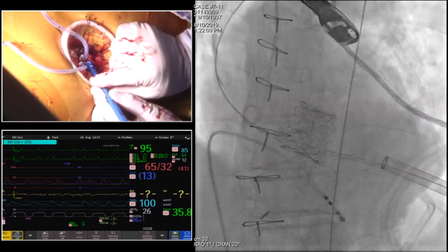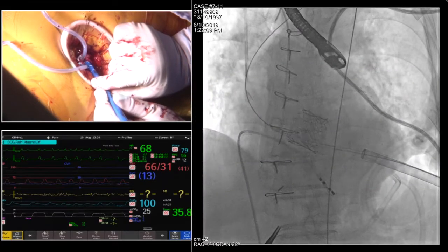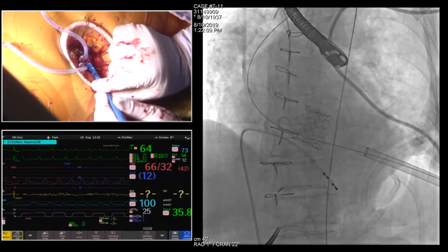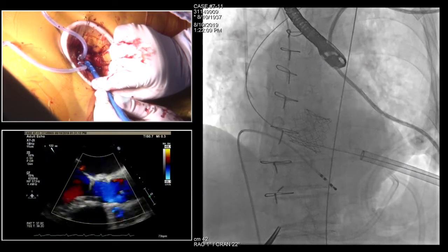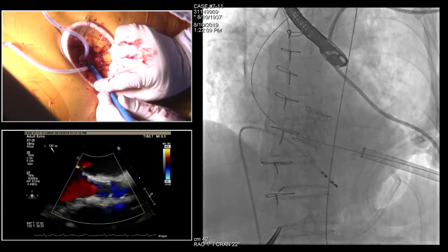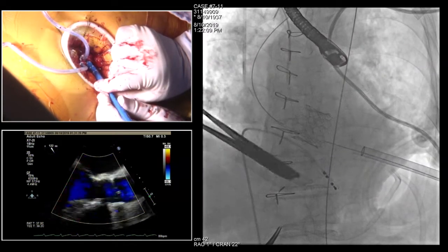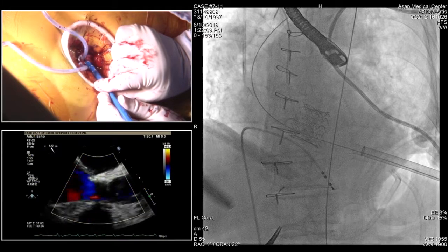I think the remarkable part about the transapical is how well the surgeon can control exactly where they put the valve. I'll pull out slowly. We haven't done it, but it is nice. No, we did a lot. One, two, three. The carotid is similar because you're on the short valve there too. Okay, good. Very good. Actually, that's what he said. You can walk away now. It's a real highlight of this slide.